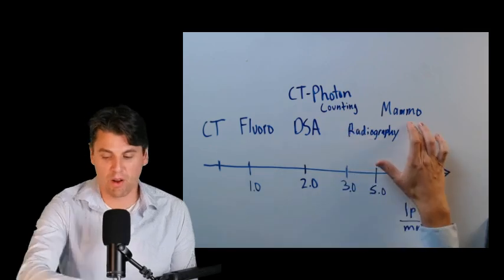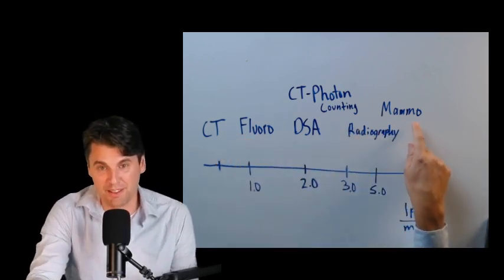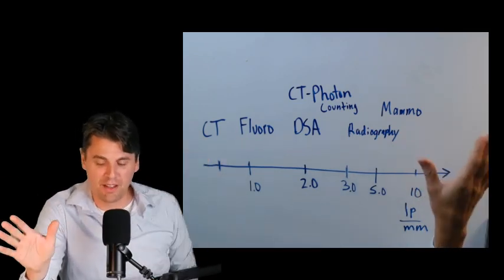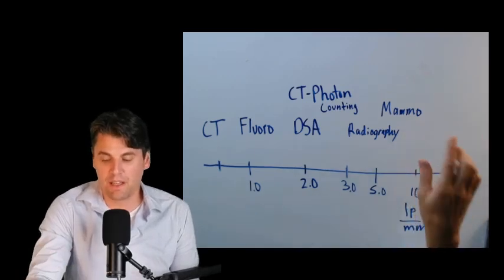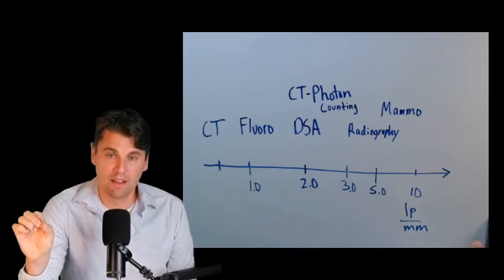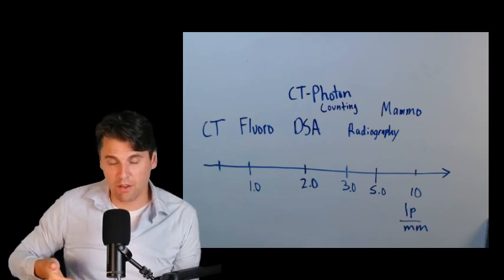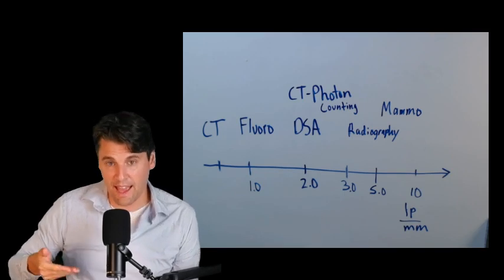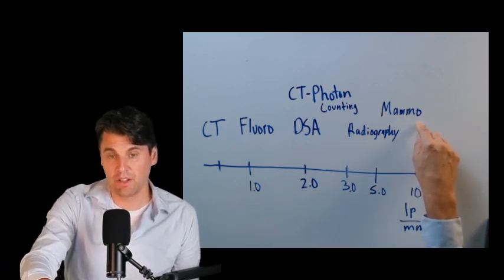We're talking about close to an order of magnitude more spatial resolution than your basic standard resolution kernel on a traditional CT scanner. Mammography has the advantage that you're looking at a small object. You can typically get a good amount of x-rays coming through on the exit, even at a relatively low radiation dose.